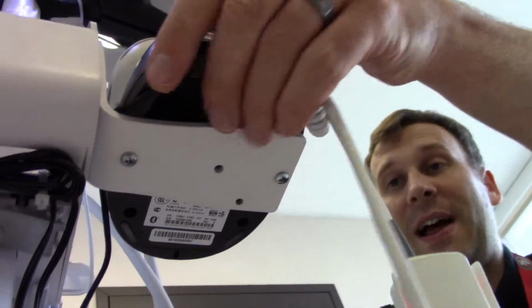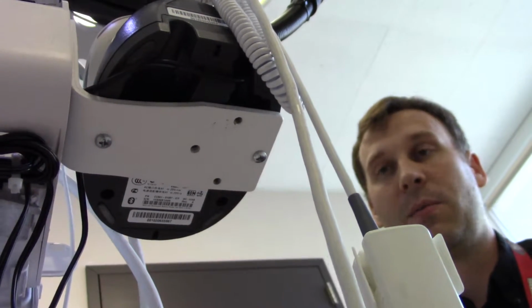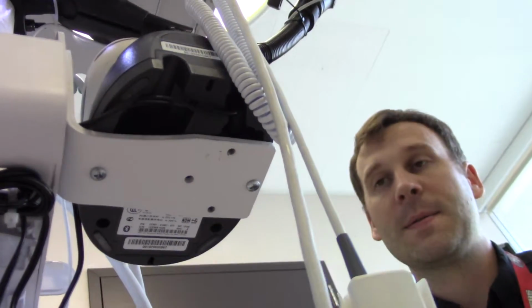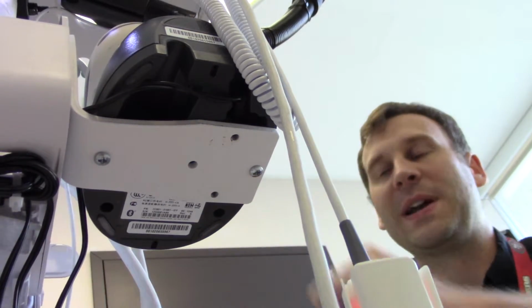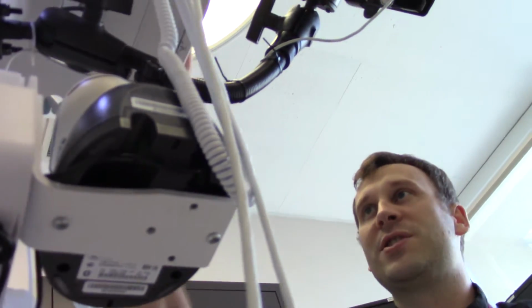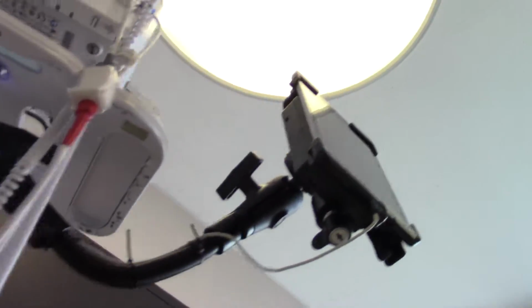And then RAM Mounts also makes an adapter to go into the base of the Honeywell 1902 scanner. So in this case, our biomed guy had some extra parts for these, and he had a little L bracket that he was able to attach here. These are very robust. These have been worked out really well, and I rarely see damage to the scanner if it's got one of those. But that's not the normal way it's attached. No, it's not the normal way, but even with the normal way, I don't really have too much issue with the scanner mounting just because it's a shorter arm. It's in under this kind of skirt here, so if there's going to be an impact, usually the top here is going to take the brunt of the impact rather than the scanner itself.